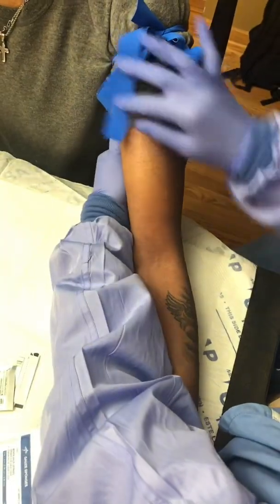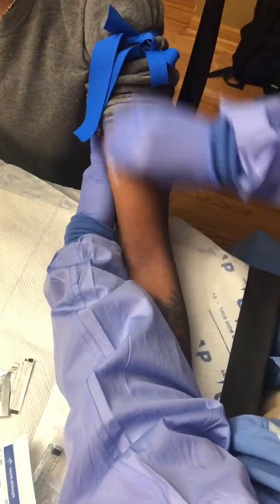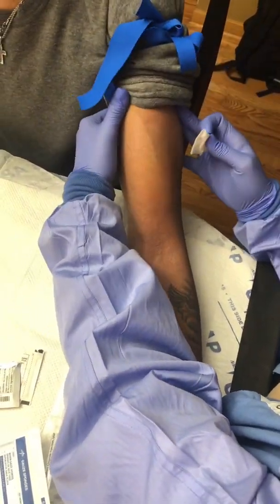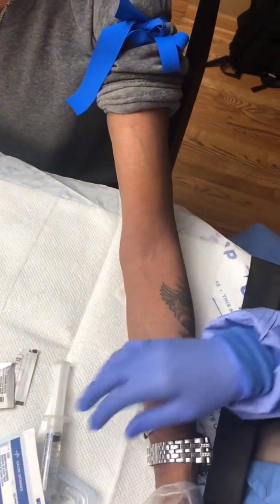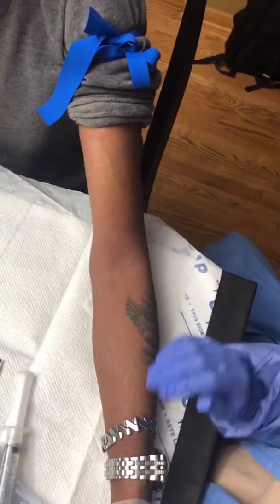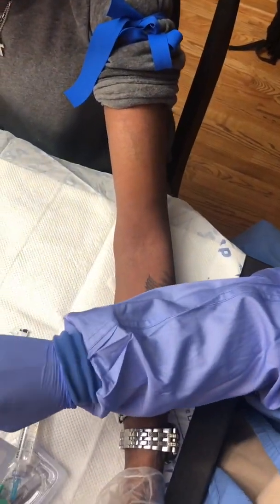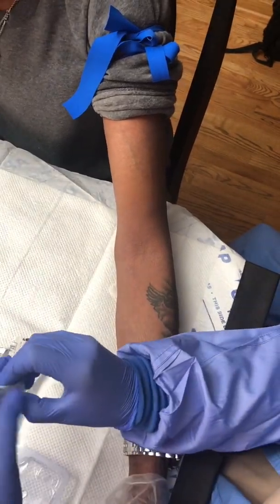Using frequent alcohol pads during your assessment of the veins is important and helpful in patients with darker skin complexions, because the alcohol moisture actually contours the vein and makes it a lot easier to see. Also, I recommend wiping with the alcohol pad in a downward motion — wiping upwards will more likely push the blood up into the valve above the location you're targeting.